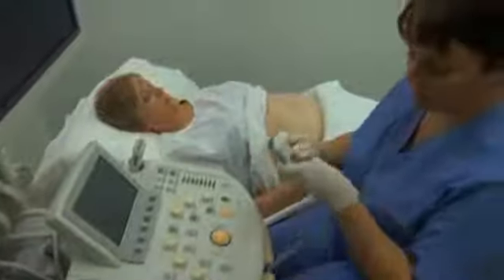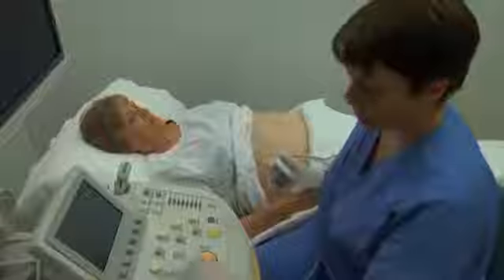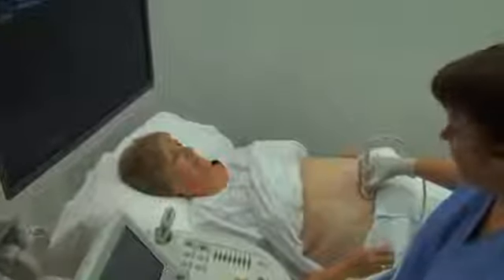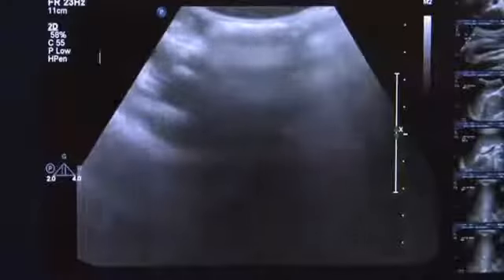Select a transducer of appropriate frequency for the scan and select the appropriate transducer setting. Confirm the correct transducer selection and preset on the ultrasound machine. Perform a survey scan of the abdomen and make any necessary adjustments to the machine settings to maximize the image quality. Scanning of the retroperitoneum and peritoneal cavity is usually performed as part of a full abdominal ultrasound study.